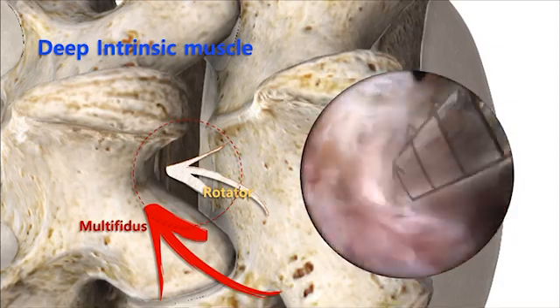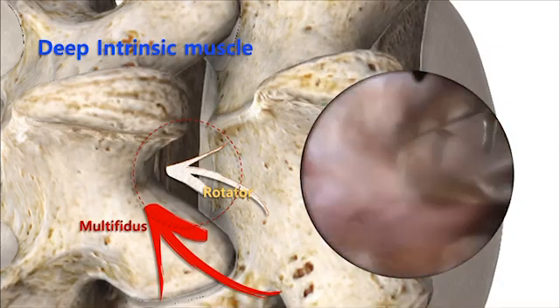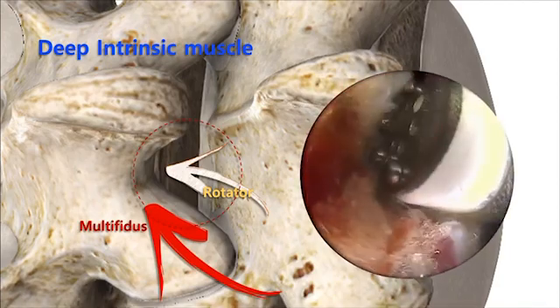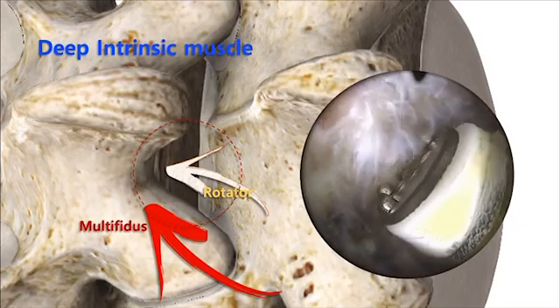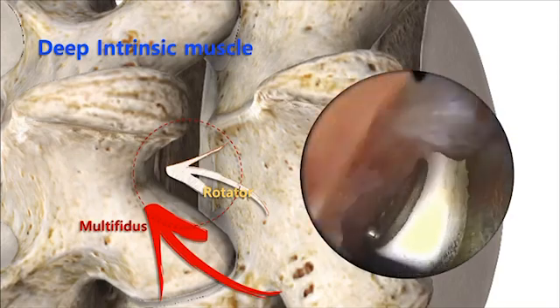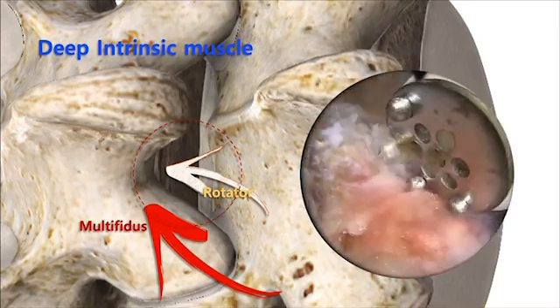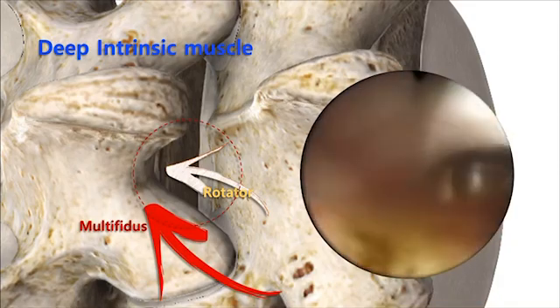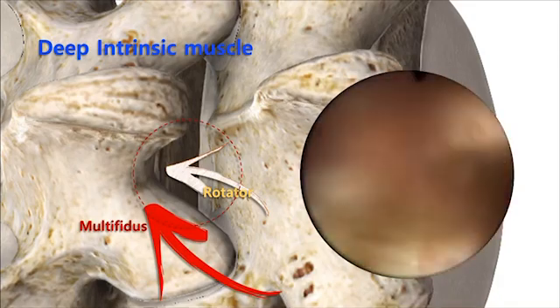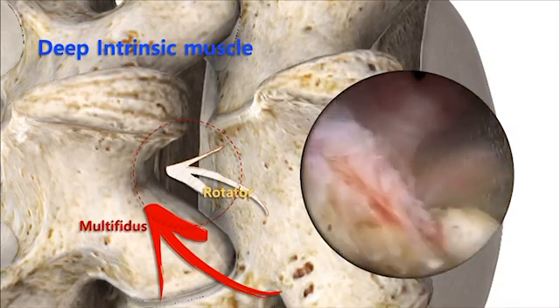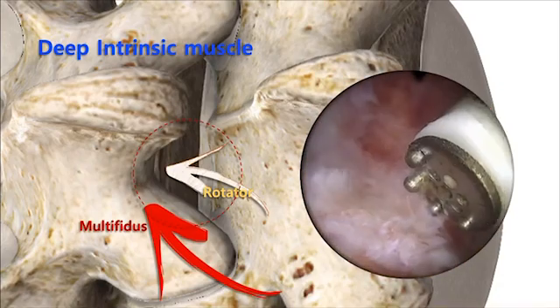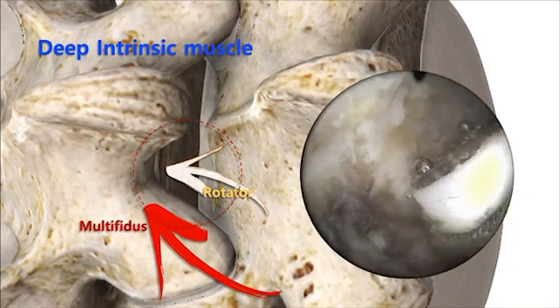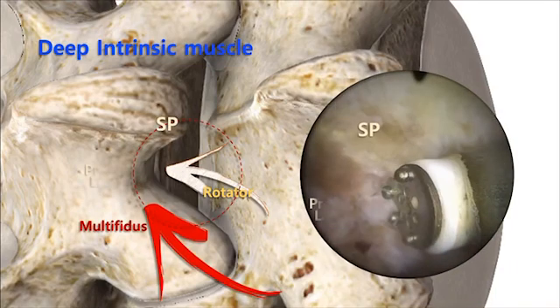You should try to remove only the basal muscle fibers in the interlaminar space and preserve the muscle fasciculus on the lamina. Don't destroy the muscle on the lamina — it is a functional structure, and when you destroy it you could encounter significant bleeding under the muscles. Save your operating time and don't waste it in the wrong place.